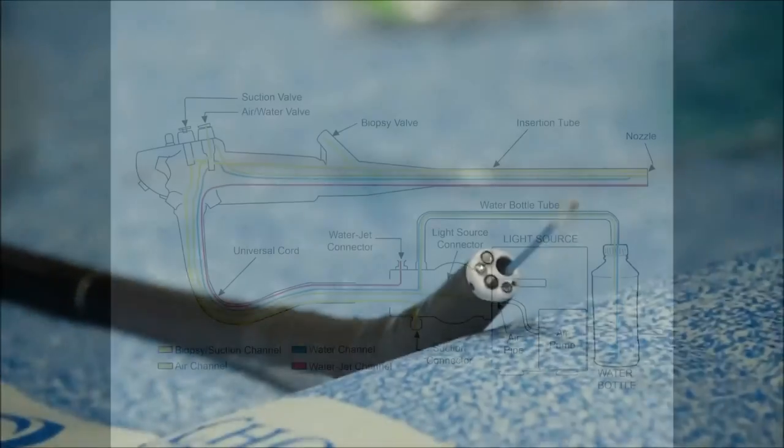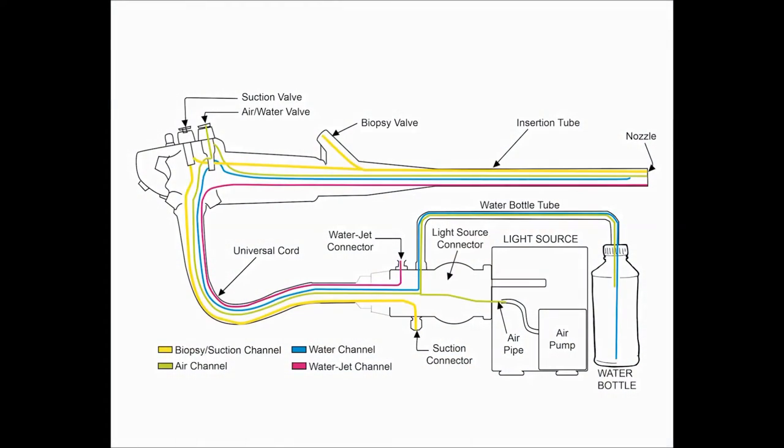Ideally if the scope has been removed from the patient, you may also find that there's an obstruction within the universal cord, here highlighted in red. If this occurs, this has to be cleaned out in a different method.